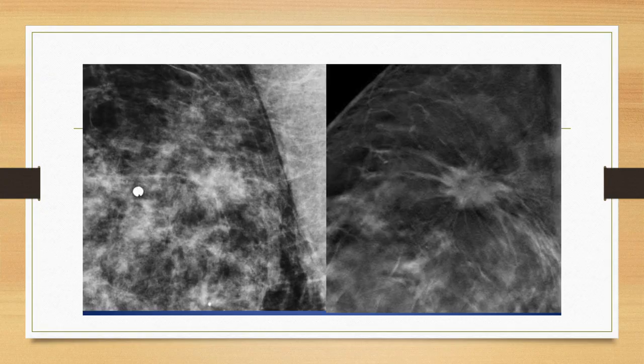Here's a zoomed-in view of another patient. Same thing, dense tissue, lots of little areas of white, lots and lots of white. Do the 3D image, and it jumps out. We see this star, this is cancer. If I biopsied this and it came back as not cancer, I would say that's not right, it needs to be removed. Classic. So it just really jumps out on those 3D images.